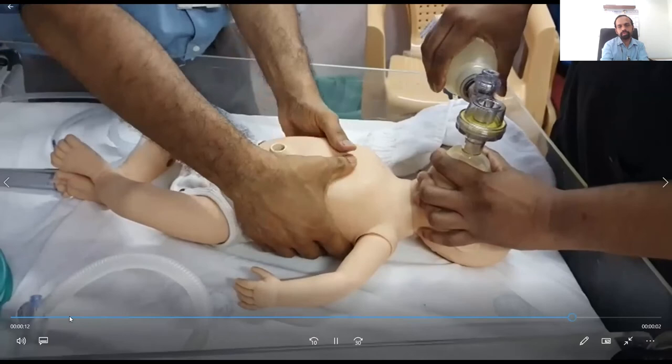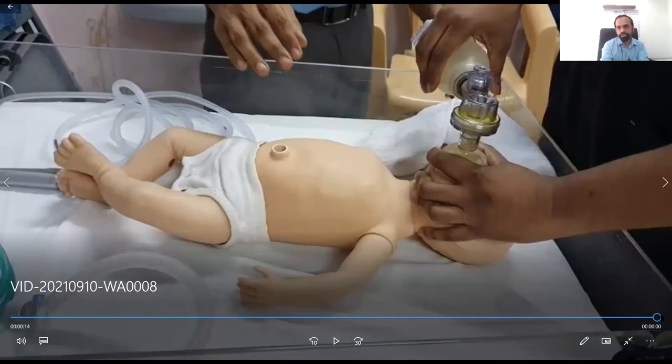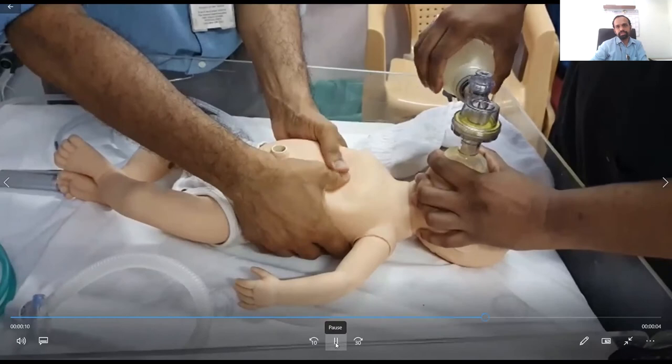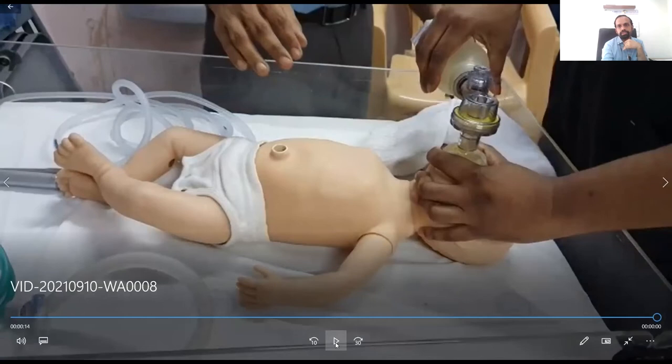A few things in this video. We should give time for relaxation of the chest, like in pediatrics. And bagging should generally be done using 2 to 3 fingers other than the thumb, so that the pressure will be 15 to 20 centimeters. If the baby requires high pressures, you can use all 5 fingers. Any questions from the audience?